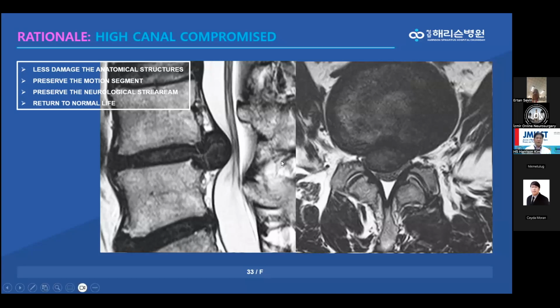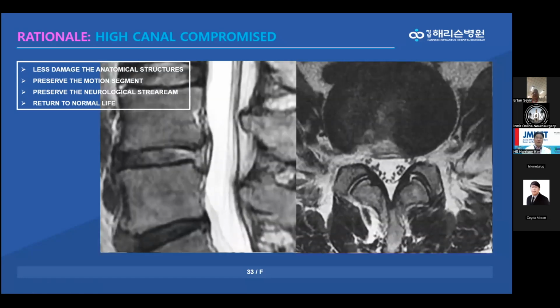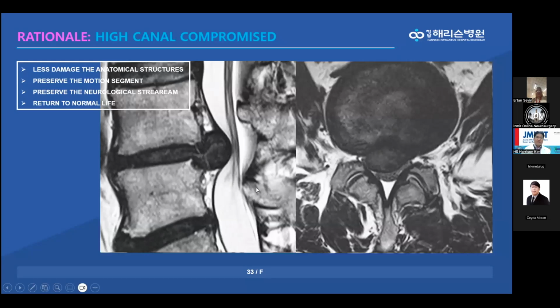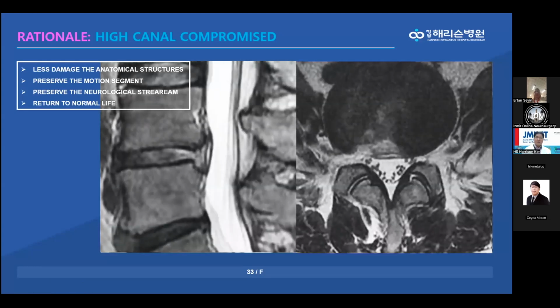Because of that, we hope that every spine surgeon, every endoscope surgeon, can achieve a result like this figure. Look here. This image is not a normal image. It starts from this image, and taking good treatment is the real purpose, so that the patient returns to his normal life.